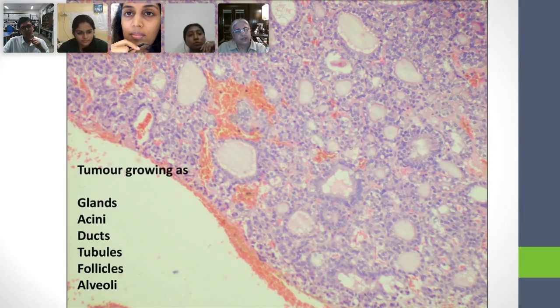It is a sac-like structure and it is large. It is not like an acinus. It's a large sac-like structure. You can't have a tiny lumen in an alveolus. You understood that? So it's circumscribed, it is sac-like, and it has some cells lining that lumen, but they don't have to be epithelial. In the alveolus of the mandible, there is no epithelium.